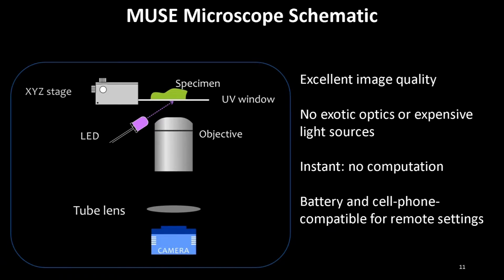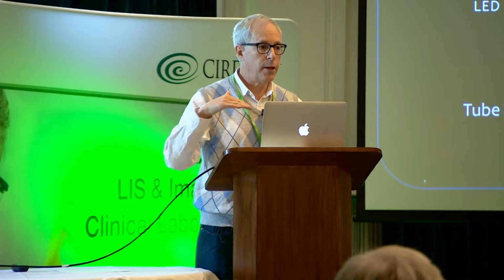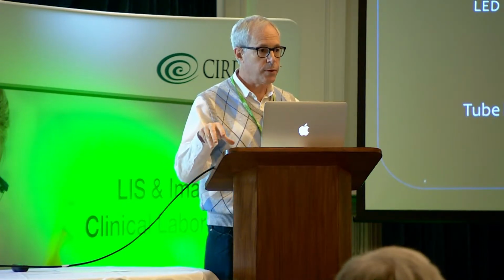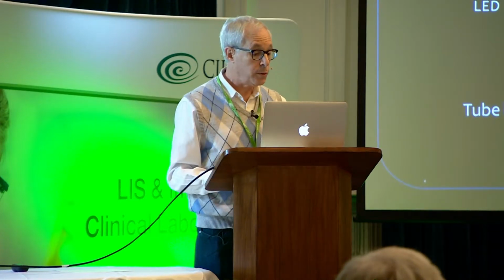So this is what he told me about, which was that light at UV wavelengths, when it hits tissue that's been stained for a few seconds in a fluorescent stain, only penetrates the tissue a few microns. And so you get the thinness of a glass slide without actually cutting the tissue. You just look at the surface. And of course, the surface is defined by you. It's wherever you cut, so you can define what you're looking at.